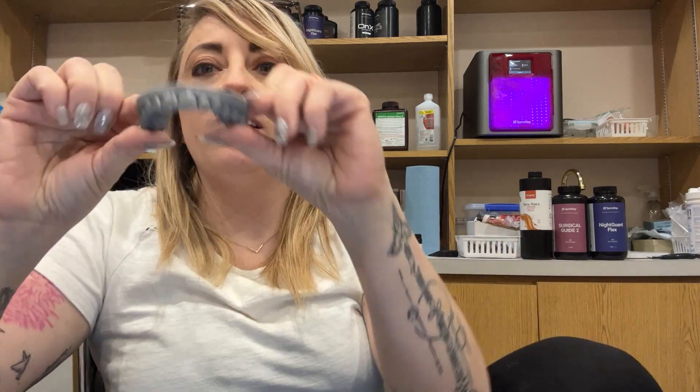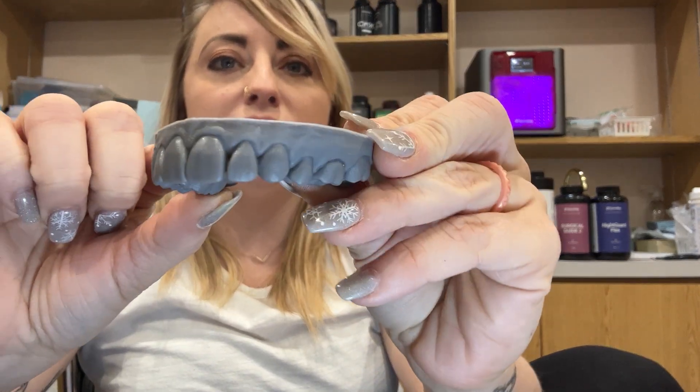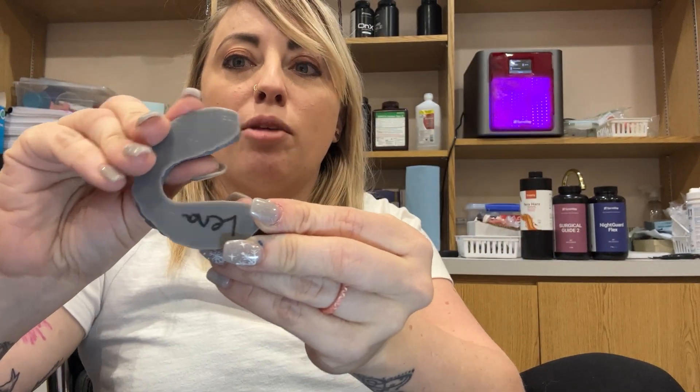After you've done it and you think everything looks great — the smile line goes nicely, we've broadened the smile like we wanted to — then we are going to just 3D print it. You can see nice, beautiful teeth. Put the patient's name on the back.